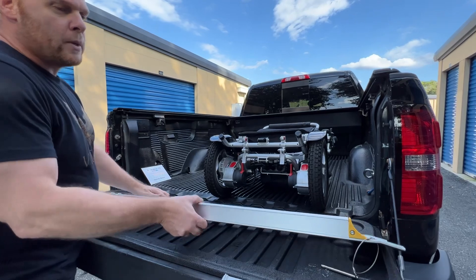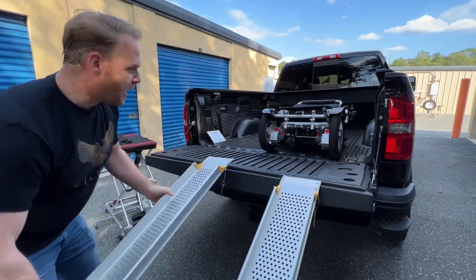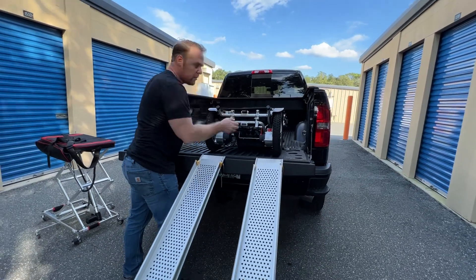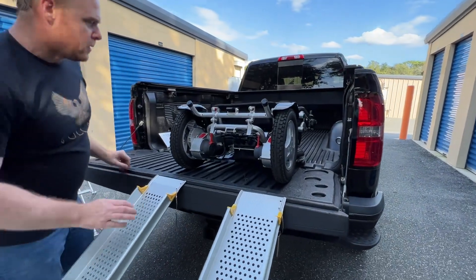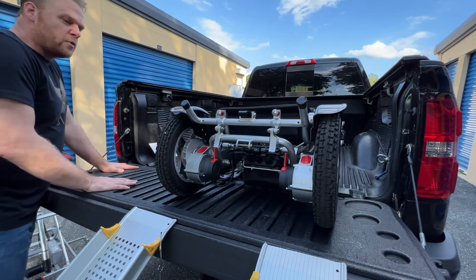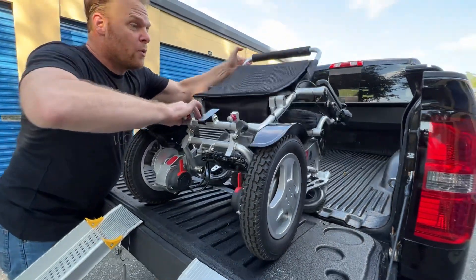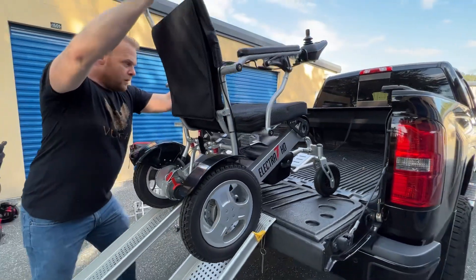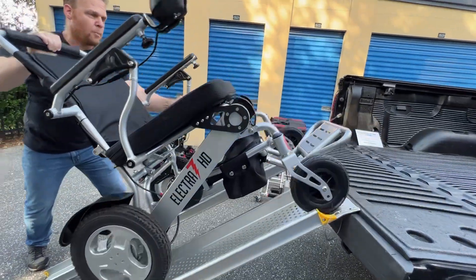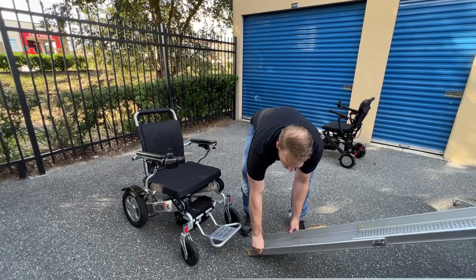The ramp just slides out. On the bottom of the ramp you have a non-slip material, so it's not going to slip and slide out of the way easily. Now I have the ramp lined up. In the previous video I discussed that you'd really want to use something like this more with a truck or van, because the sport utility vehicle is not really going to cut it. You can see how with the chair folded, the front wheels are not making contact with the ground — that's not necessarily good. The chair itself needs to be in freewheel and open. It does take a little core strength to ease the chair down the ramp.